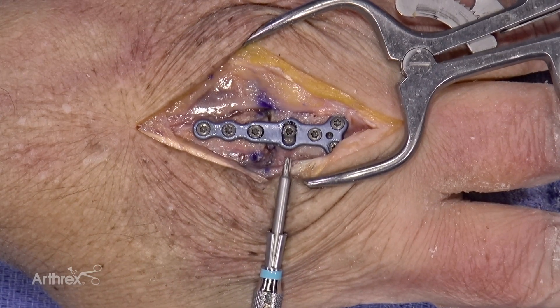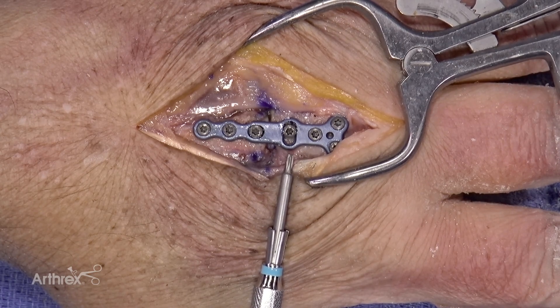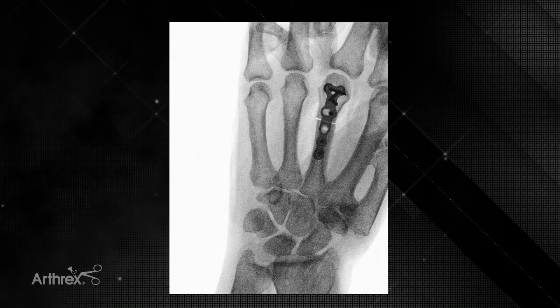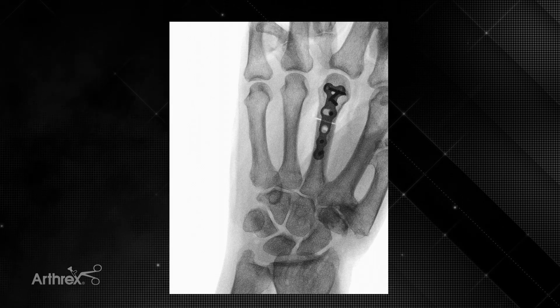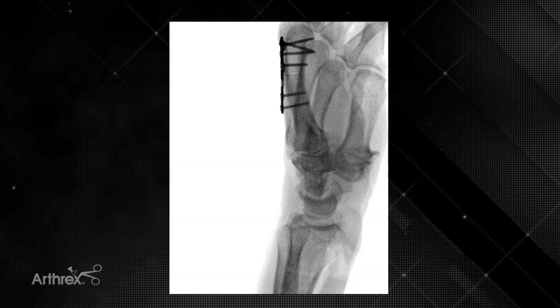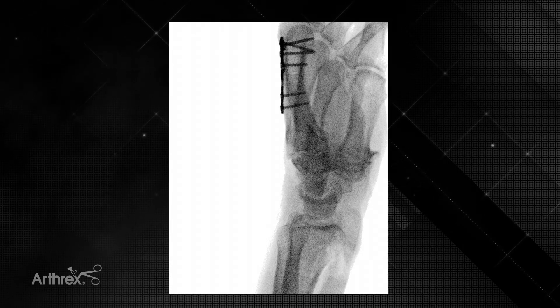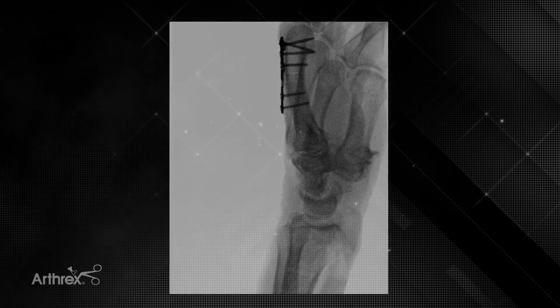Once this is completed, final radiographs will be obtained to confirm reduction of the osteotomy and appropriate placement of hardware. Things to look for on your post-procedure fluoroscopy x-rays include reduction of the osteotomy and alignment of the hardware — particularly such that the screws in the proximal segment of the plate should be in line with the x-ray beam, and the screws in the distal segment of the plate should be offset and angulated the amount that the osteotomy corrected the rotation.